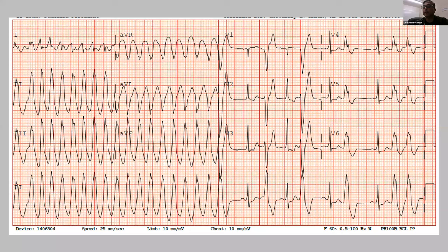We did an echocardiogram, echo was normal, normal LV function, normal RV function, normal RV size. Yes, Abhis Bhai, in the sinus beat, sir, there is possibly pre-excitation in the sinus beat on the right side. If you look at the rhythm strip below, you can see some slurring in lead 2, and of course V1, V2, V3, but the PR is not very short.